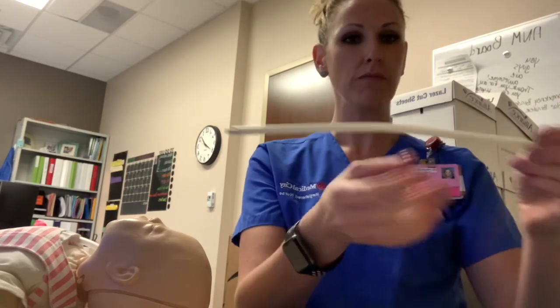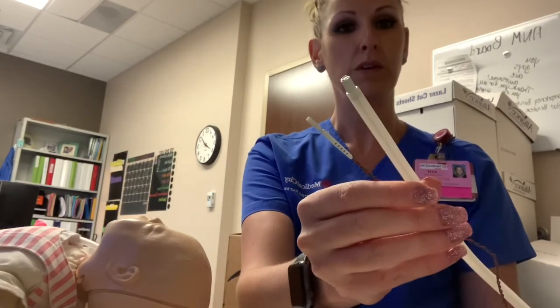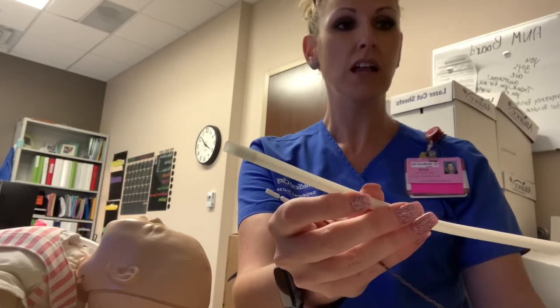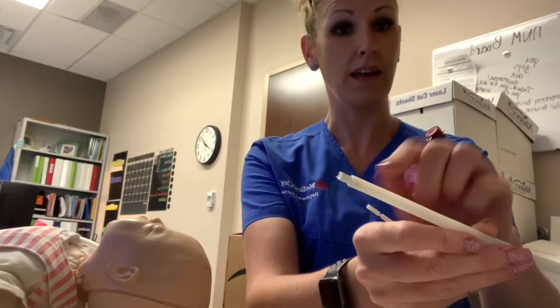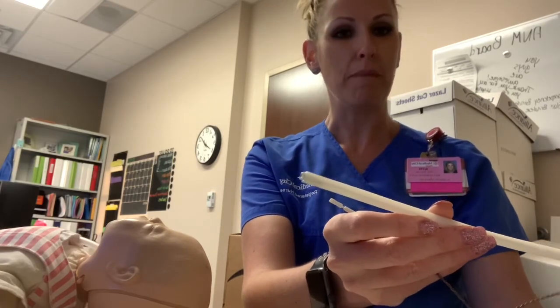We're going to open up the package at the patient bedside, make sure the patient is prepped and in a position in order to place the fetal scalp electrode. We are going to put our gloves on, and then we're going to inspect the fetal scalp electrode. We're going to make sure that the integrity is good, that it's locked, and then we're going to pull the wire back in the sheath just a little bit in that guide, because if we enter the vaginal canal with the electrode piece, we have the potential for scraping the vaginal wall. So we're going to slide that back a little bit.